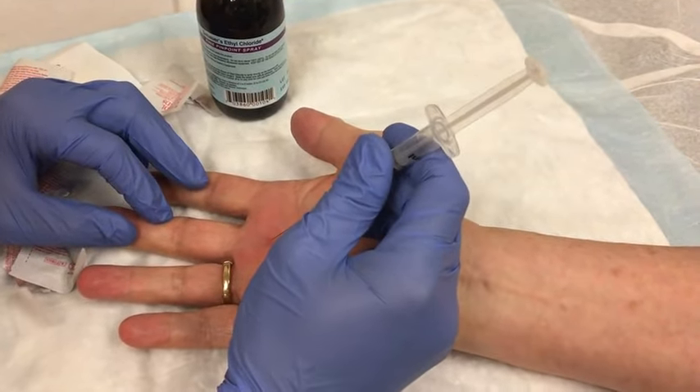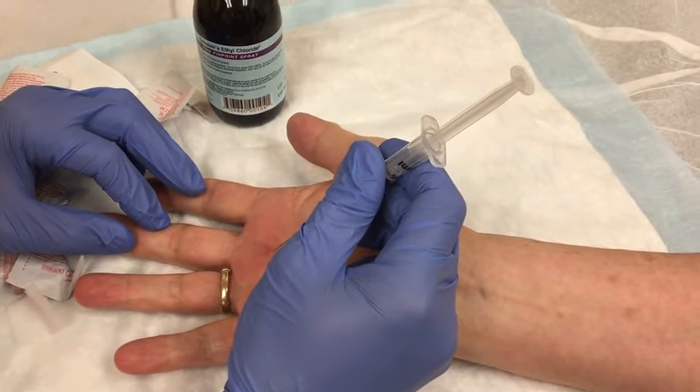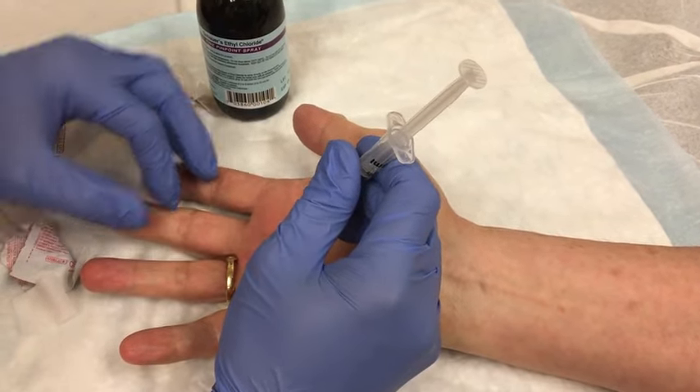Go in at a 45-degree angle. And a little pinch — one, two, three, and pinch. And I go in nice and slow.